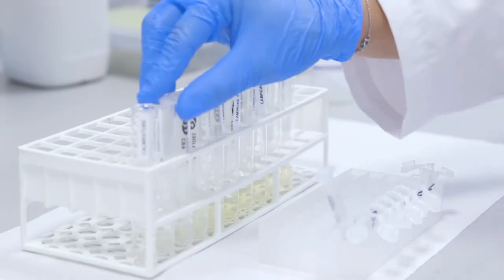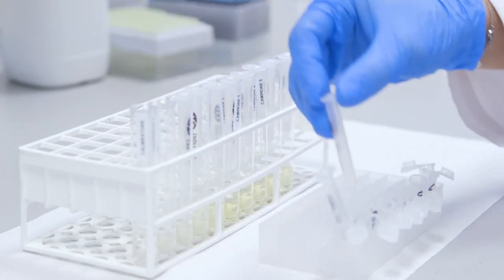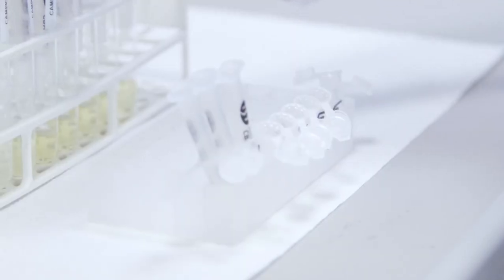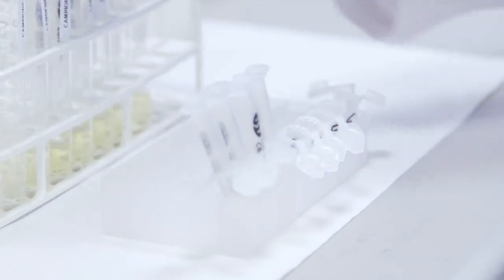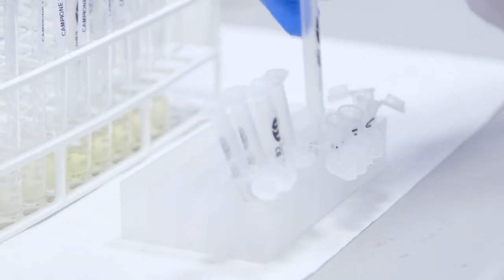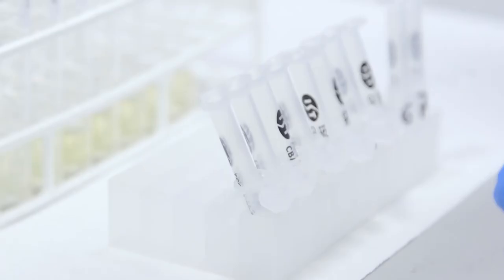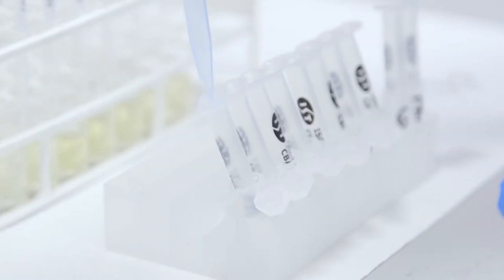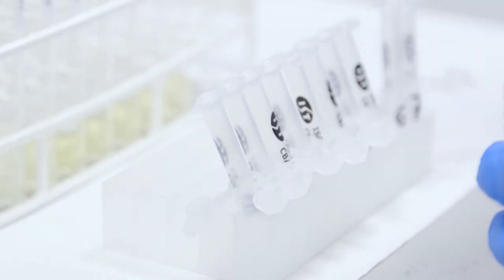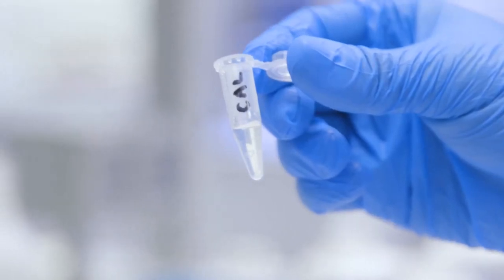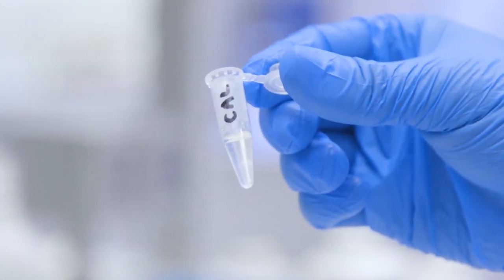Now we move on to the elution and collection of catecholamines from the SPE columns. Place the SPE column inside clean collection tubes. Add 400 microliters of reagent F to each SPE column taking care to collect the eluate. The elution takes place slowly for about one minute.